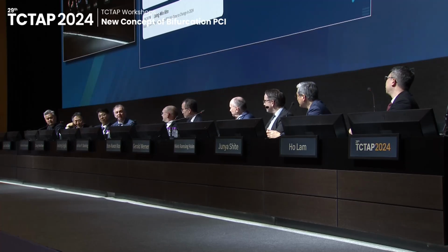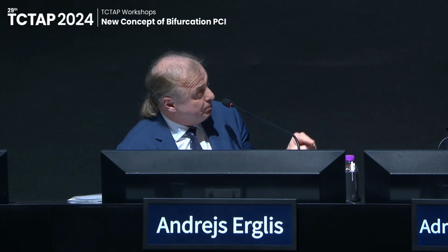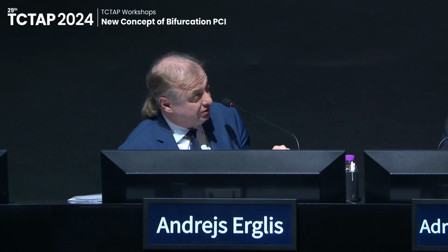Yeah, but honestly, guys, you are talking about left main, but left main is more or less clear. I guess for us it's much more important to talk about bifurcations again, and the necessity of considering the myocardial mass, and of course, I completely agree. But Niels, you also remember when we did imaging analysis, we saw how after kissing balloon we really changed the geometry. And that also was one of the points where we started to use POT much more. And, yeah, as you then mentioned, about this fractal geometry.